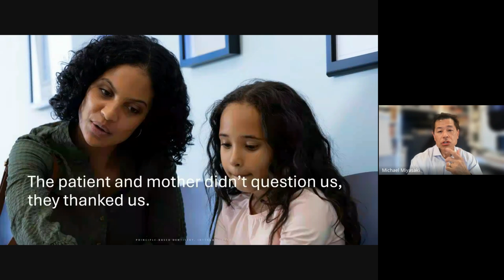we did not have to convince the parent why we needed to do this. She knew. So again, when we're in that situation where from the outside, the patient's looking into their child's mouth and they see maybe a little bit of a groove in that tooth, where there's some early decay, and we tell the patient, well, we may have to do a root canal, that's a shock to them. But in this case, because of the QBLISS equipment, because we could explain that the red color is the bad areas of the tooth and how extensive that was, the mother and the patient, they didn't question us.